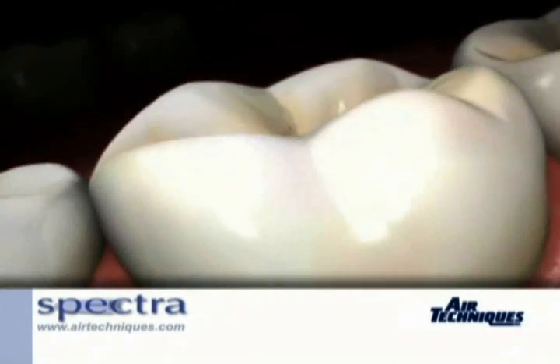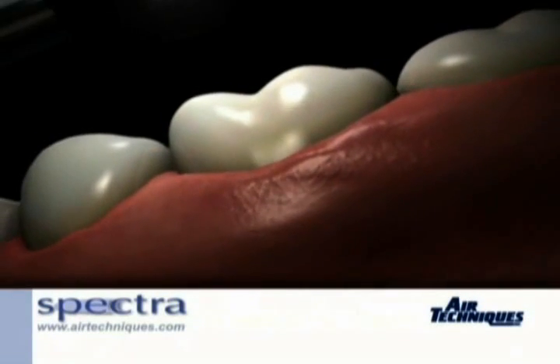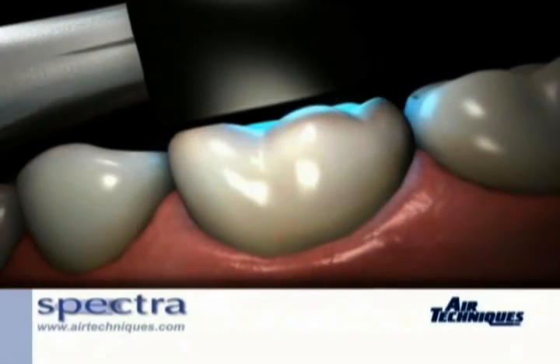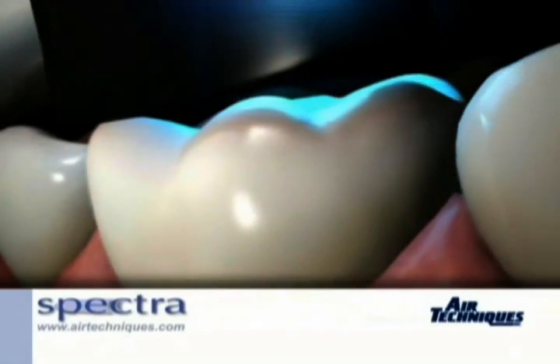Key to the Spectra system is a fluorescence-based handpiece that identifies decay-causing bacteria. Approximately the size of a toothbrush, Spectra is the ideal complement to an X-ray imaging system for improving the standard of patient care.